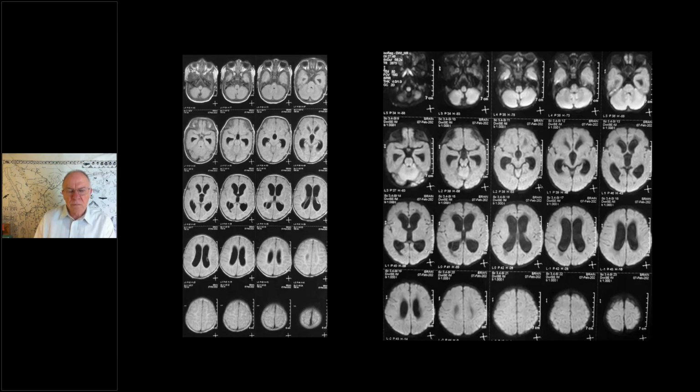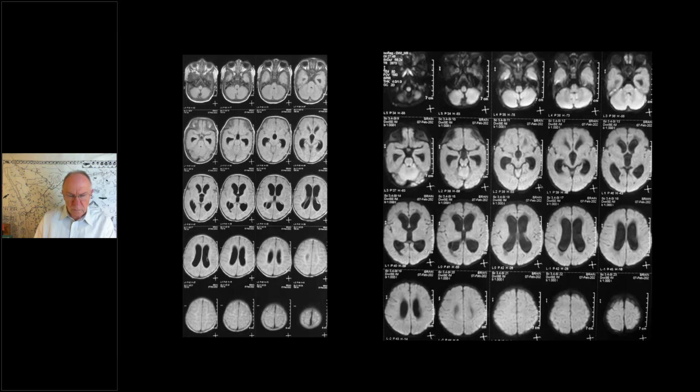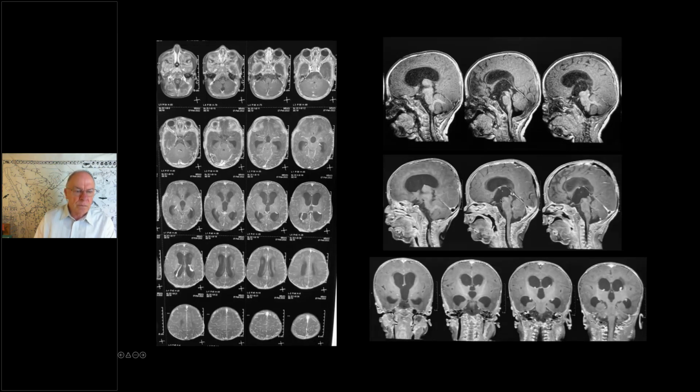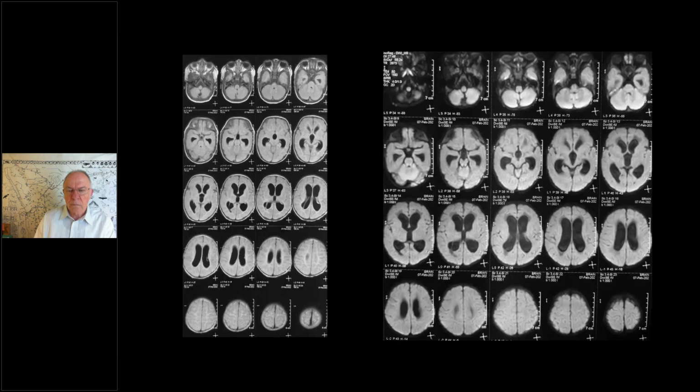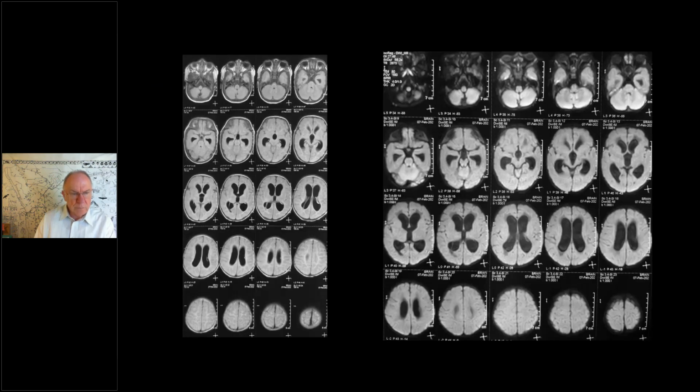So any comments from others? I think between both scans, the child has developed infection, and the infection has caused obstructive hydrocephalus with some adhesions or septation at the level of the aqueduct. That is not related to the initial presentation of the child because the child had symptoms before we saw the hydrocephalus. So it can still be a genetic possibility, but the hydrocephalus is probably not related to the genetic condition.